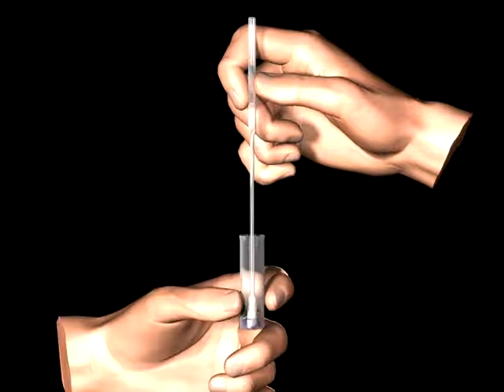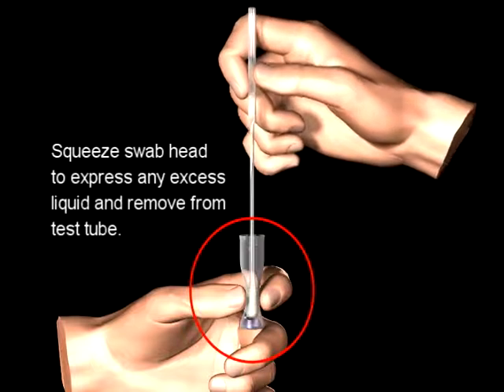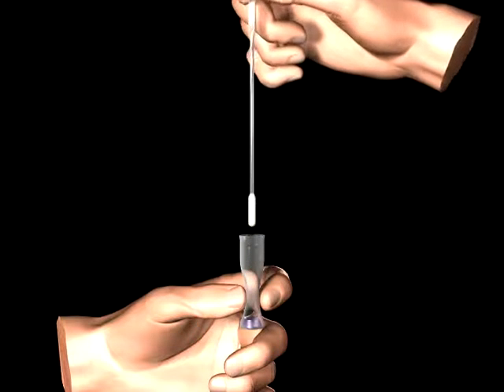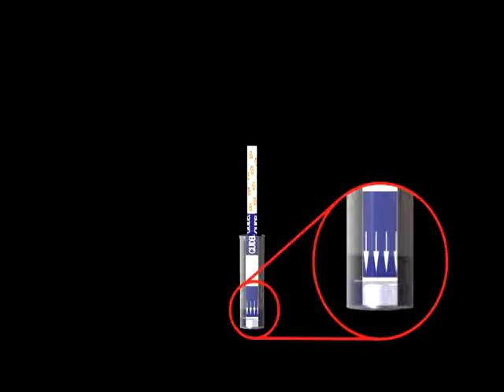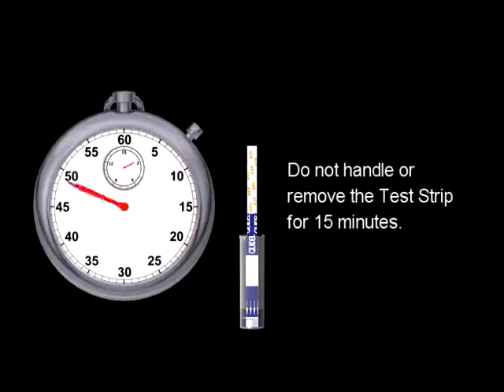Express all liquid from the swab head by squeezing the test tube as the swab is removed. Remove the test strip from the foil pouch and place it in the test tube containing the extraction reagent and patient sample. Make sure the arrows on the test strip are pointing down. Do not handle or remove the test strip for 15 minutes.